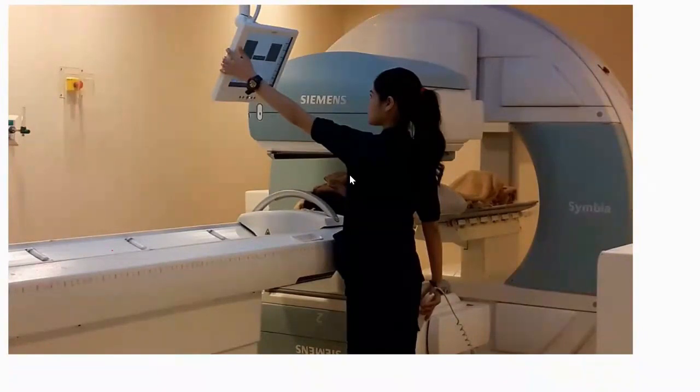There are guidelines, for example, from the European Association of Nuclear Medicine, or the Society of Nuclear Medicine and Molecular Imaging, both American and European, which publish guidelines in the field of nuclear medicine. These guidelines dictate how you should inject the patient, account for dose, work with matrix size, and set scan time. All this information is included in your guidelines. So when you come to adjust the protocol, you take these values and work with them accordingly.